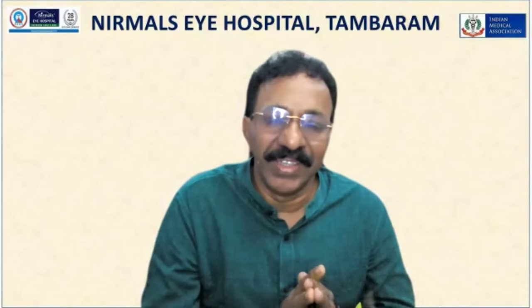So it is necessary you maintain this on a day-to-day basis because any legal thing can happen suddenly. And the first thing the police or the investigative agency do is capture all your master logbooks and documentation. So that is one of the reasons why documentation has to be done then and there in chronological order. So don't bring NABH into each and every issue. It is a government regulation and a requirement from the licensing point of view.